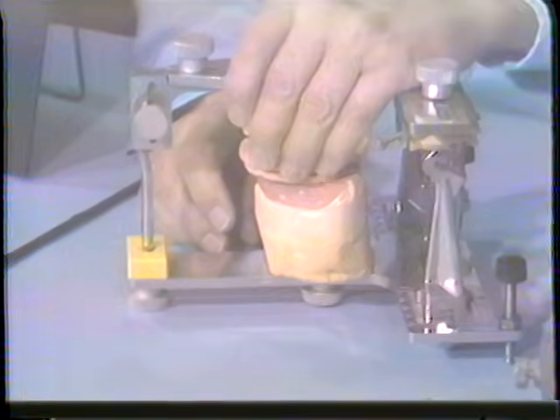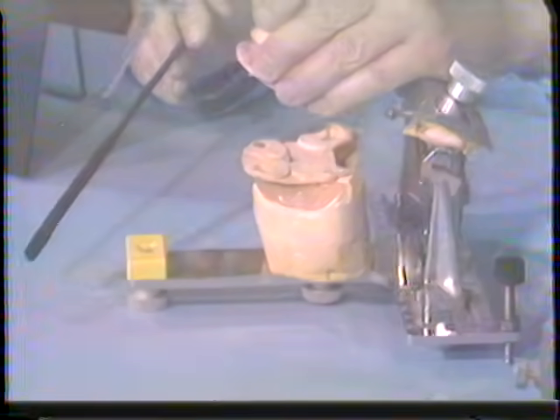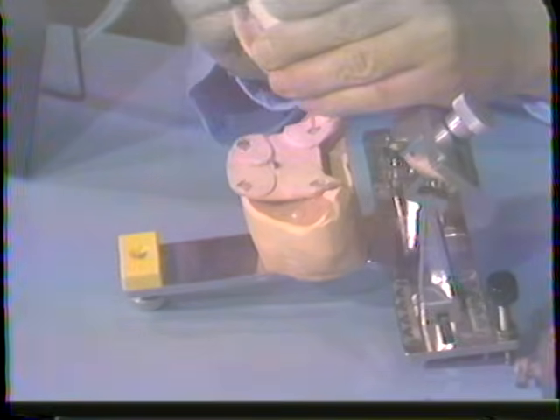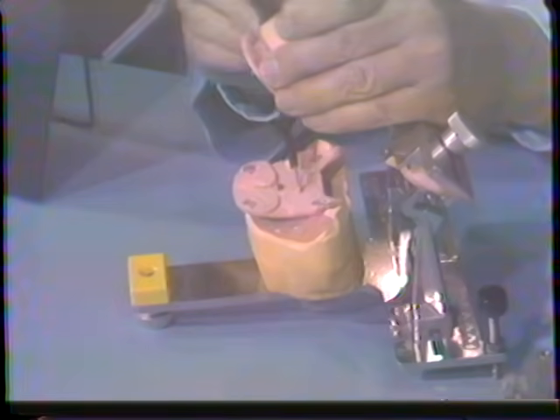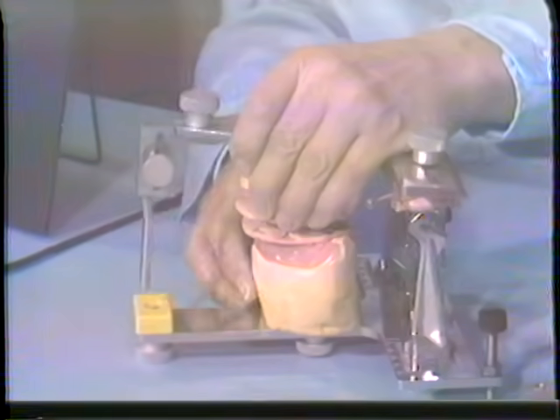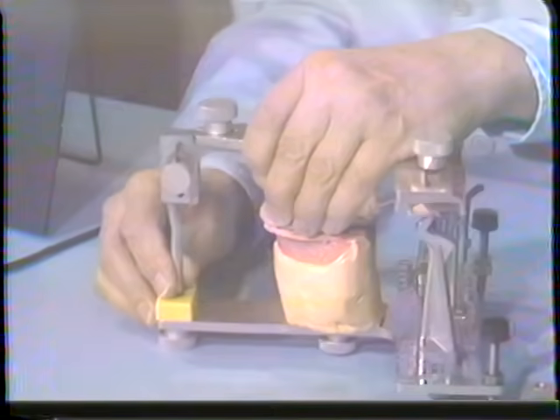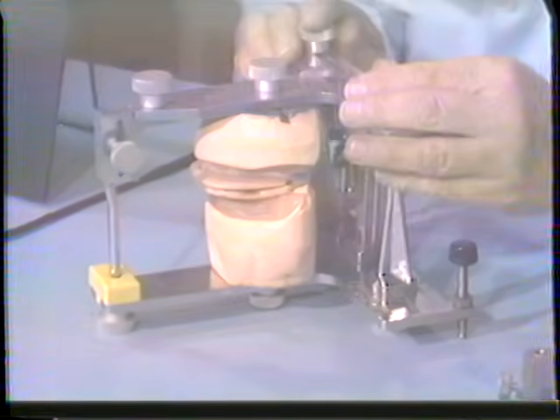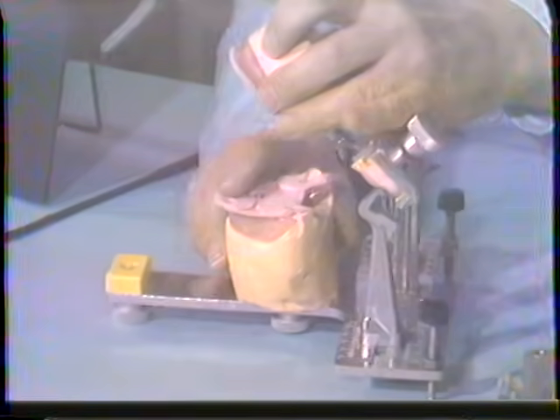An engraving method implies that we trace out in the patient, either on compound with some studs mounted in the upper, or as shown here in plastic, the various movements of the mandible. In other words, four studs contact below, the patient moves the lower jaw around in definite excursions, protrusively and laterally, and we come up with the tracing, and the instruments can be adjusted, or the instrument guides can be adjusted now to the tracings made in the mouth.